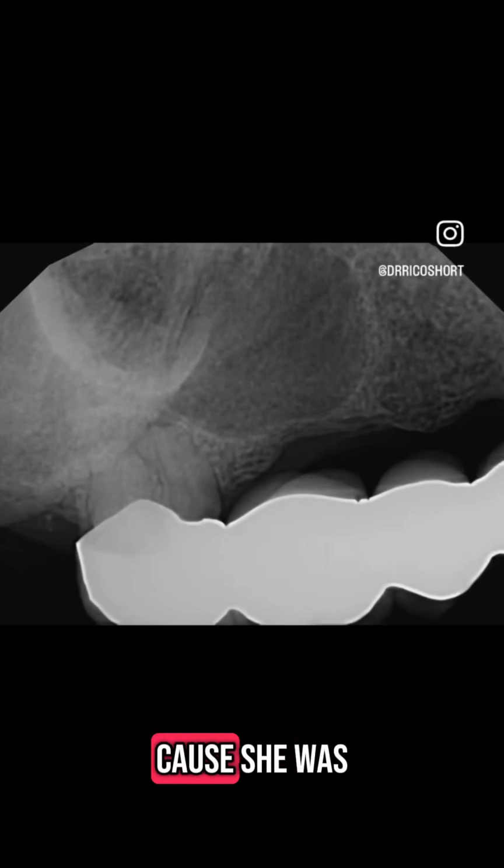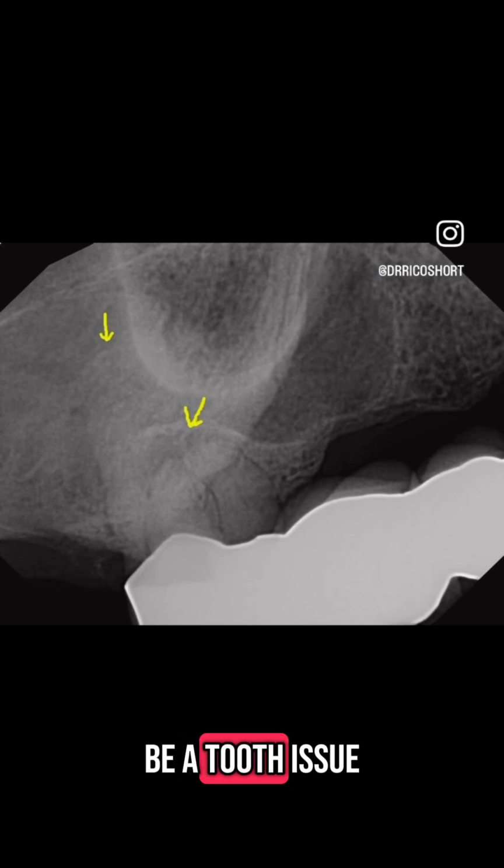This patient came to see me because she was dealing with some sinus issues on the upper right. So she said it could be a tooth issue. We did a 2D image. We didn't see much, so we decided to do a limited field of view 3D CBCT.